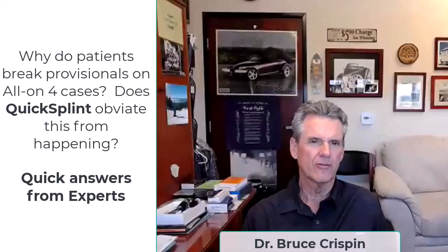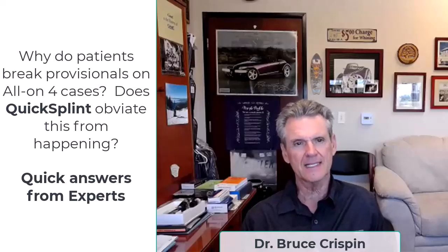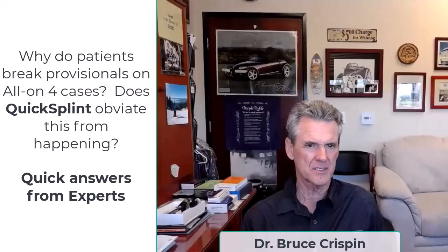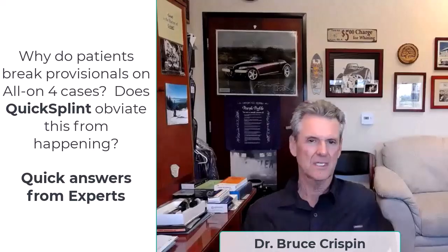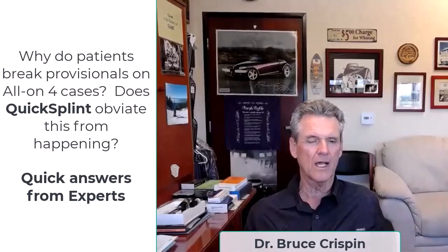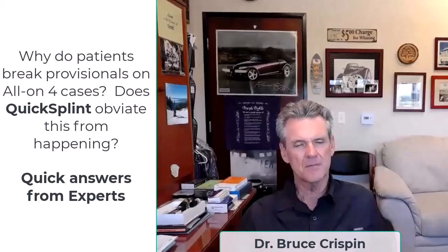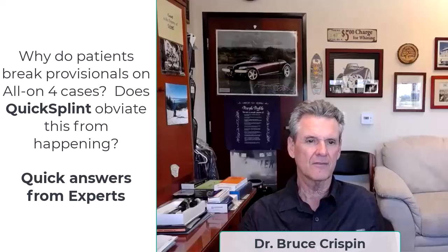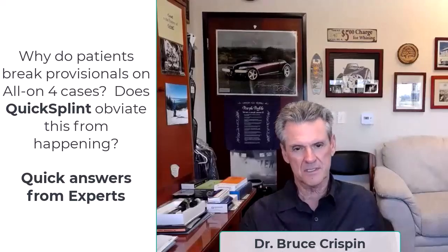With implant-supported full arch restorations, usually if patients are breaking their provisionals, it's really diagnostic and shows that they do have possibly some occlusal problems, or maybe the design of the prosthesis just isn't correct. A lot of times it's just that patients who haven't had teeth and got a whole new arch full of teeth take a little while to adapt. The QuickSplint can be useful to protect these prostheses, but also to relax the muscles, so you can develop a good, stable occlusal position. And once you've determined a good stable occlusal position, if you have any failures, it's more a matter of just prosthesis design.